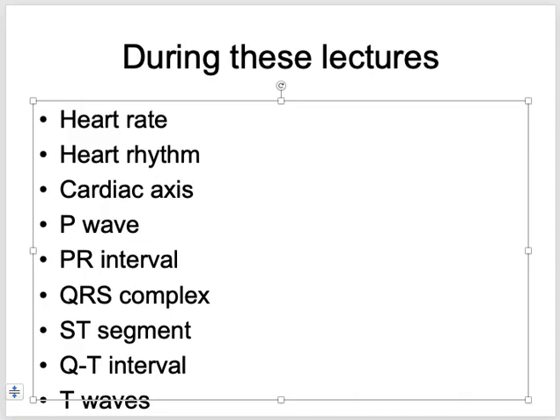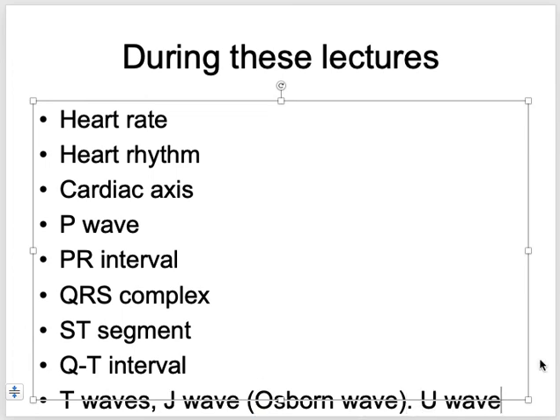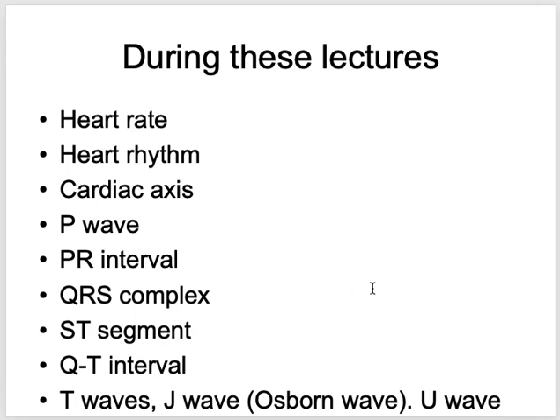So that's all, guys, for the ECG things. And after T waves, I also talked about the J wave, which is also called the Osborne wave, as well as the U wave. Not so important, I'm telling you, it's not so important to go into detail of that.